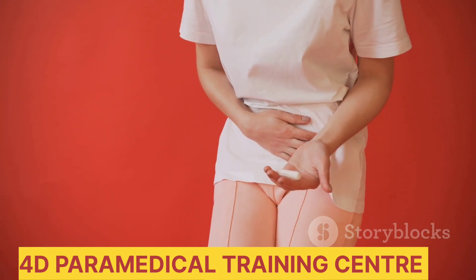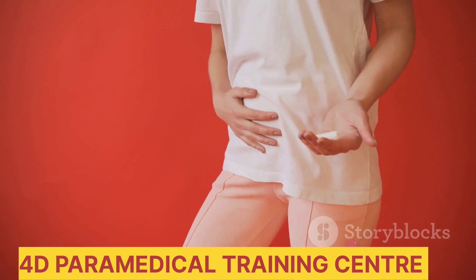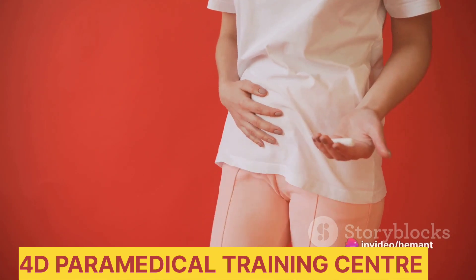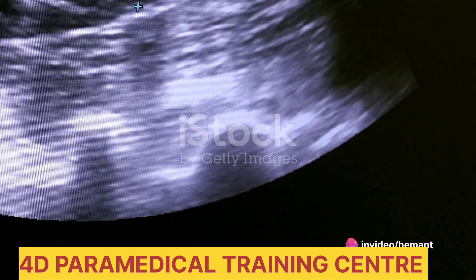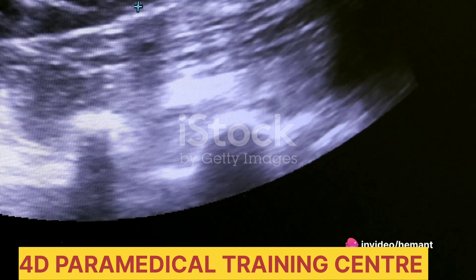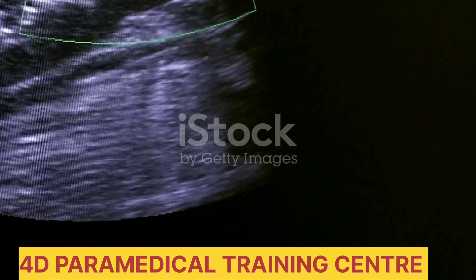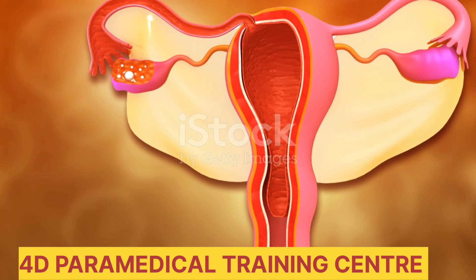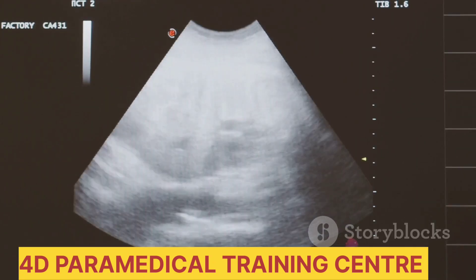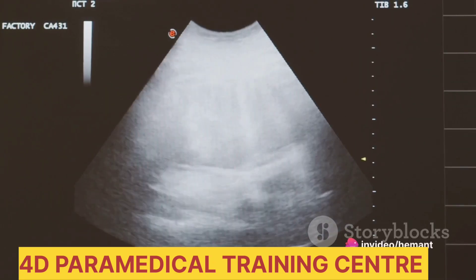The uterine cavity's opacification, or the degree of opacity, is also typically normal. Opacity is a term used in radiology to describe how much body tissue or fluid stops the passage of x-ray beams. Normal opacification means that the uterus is healthy, without any abnormality that might block the x-rays.